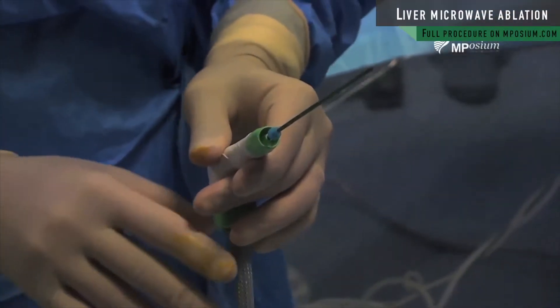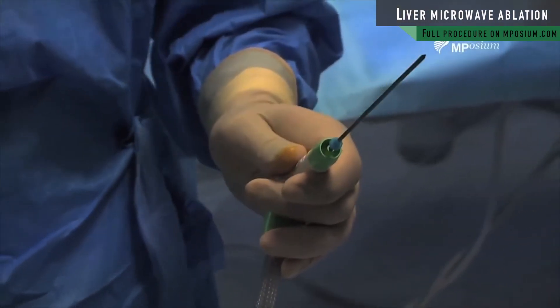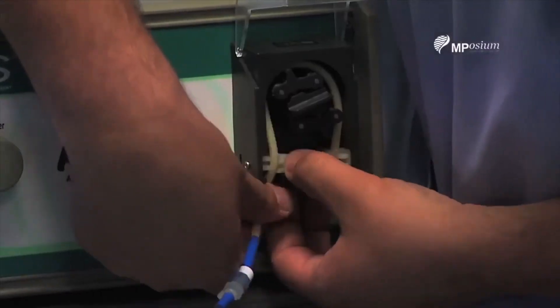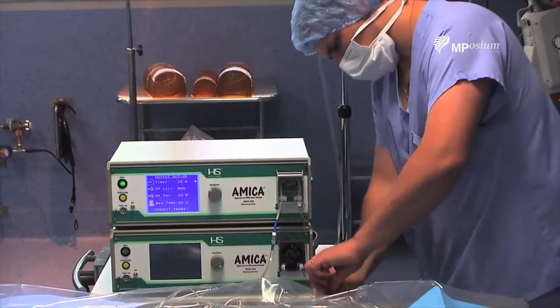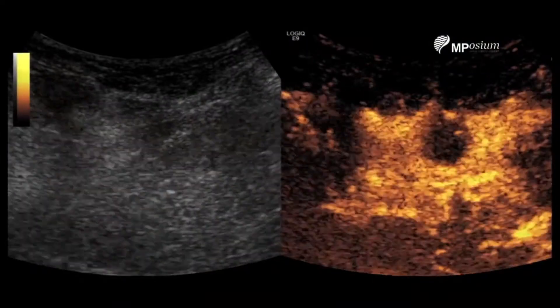I'm going to perform around a five or six minute treatment at 60 watts using an internally cooled needle. We're now connecting to the pump — the system is ready. As you can see, I'm perfectly positioned.